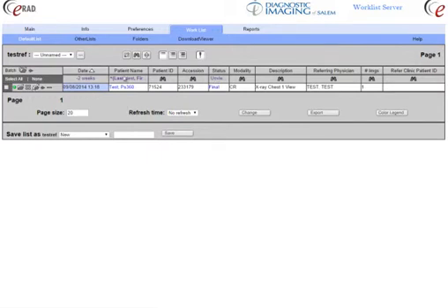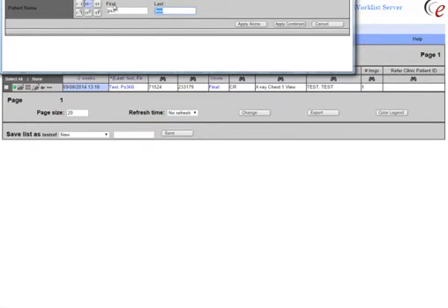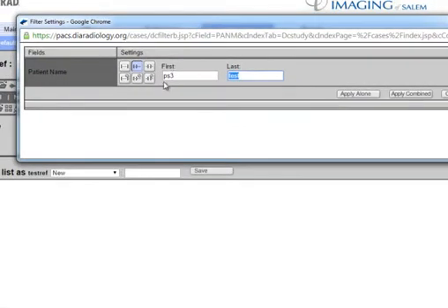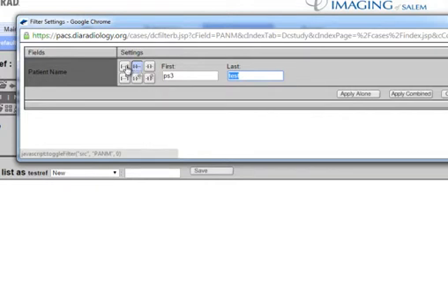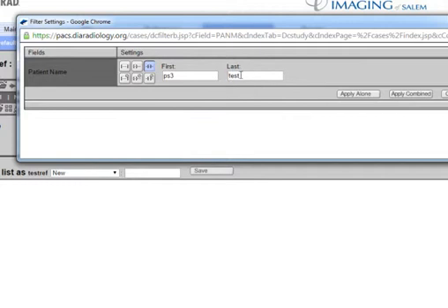If I just want to look for a patient's images, I've got my criteria up here. I'm going to search for a last name of 'Test' and a first name beginning with 'PS3'. The search option is set to 'Begins'. The other option is 'Is', which is basically an equal-to — whatever you type is exactly what it looks for, which is usually difficult to search by. I typically use 'Begins', or 'Contains' if I'm not sure — that will find the term anywhere in the name, not just at the beginning or end.